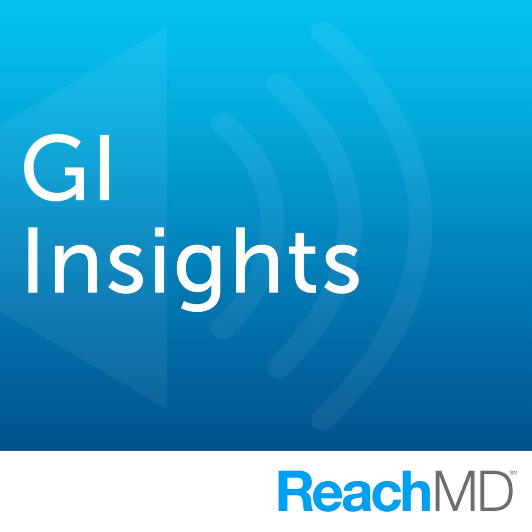It's significantly less expensive, and it is, in the places where it's available, often a test that takes less time to do and is also a test that is more available than waiting for a scheduled imaging exam. In the United States, it's astonishing when you look at the price, or at least the charges for MR enterography and CT enterography, and you compare them to the ultrasound. So from that point of view, it's superior.